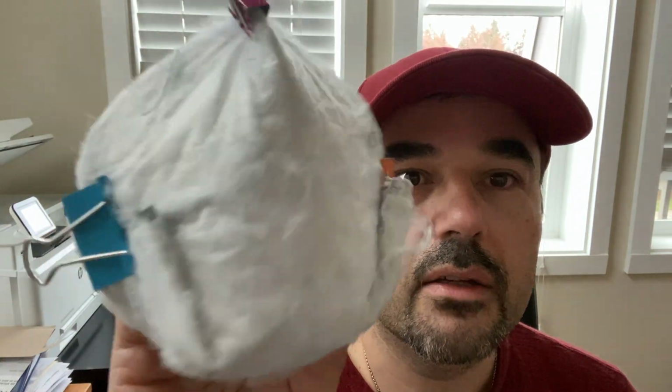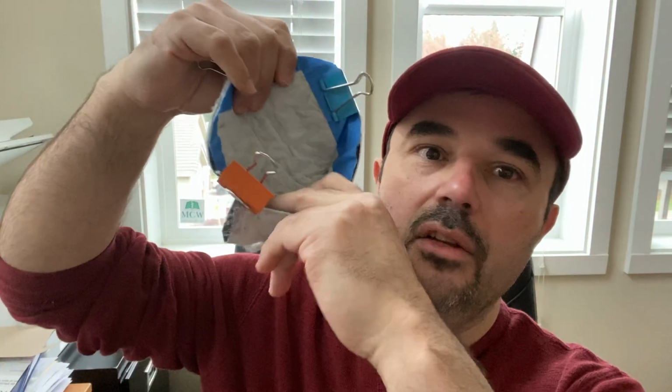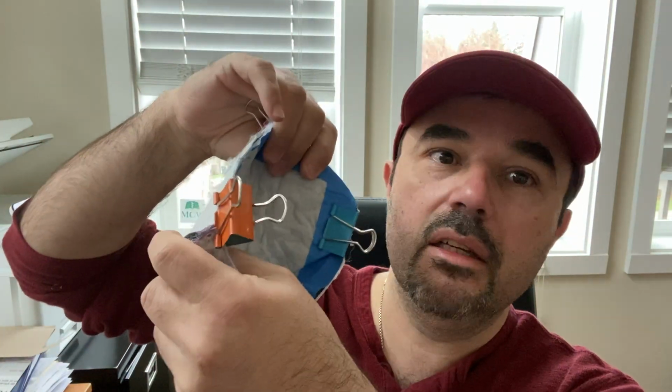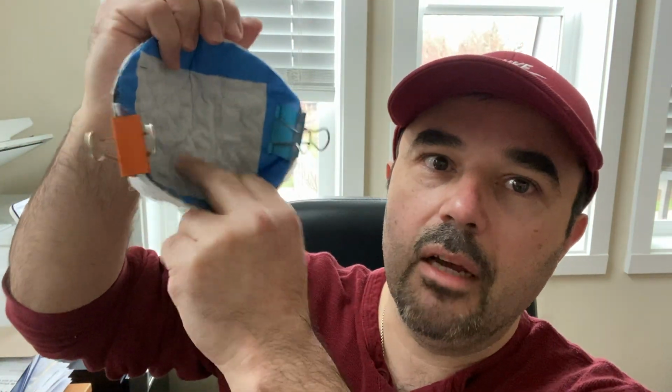All right, so now you have something that looks like this. So you're getting pretty close. So again, dry fit that. And sometimes what you have to do is kind of use your hand to expand the mask inward so you have more room to breathe. So, use your hand and kind of open that up. All right, so now you've got your mask.